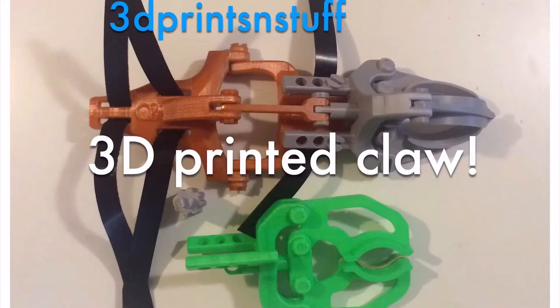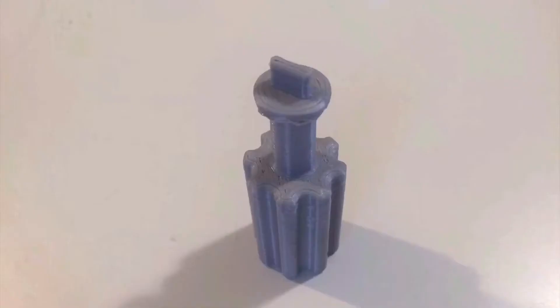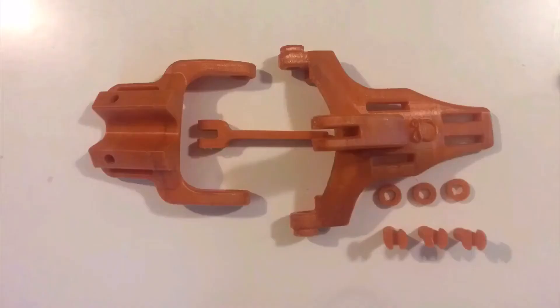3D printed claw. It has multiple attachments. Links and stuff will be down below.